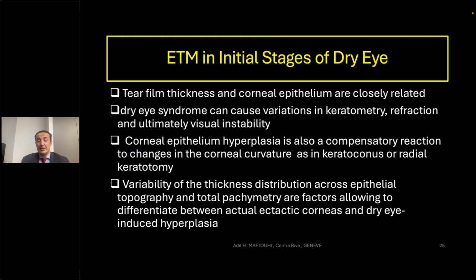But you have to distinguish the hyperplasia due to dry eye and hyperplasia due to other aspects like keratoconus, and it is always useful to compare epithelium mapping with total pachymetry and the stromal mapping, and also with the meibomian gland imaging.